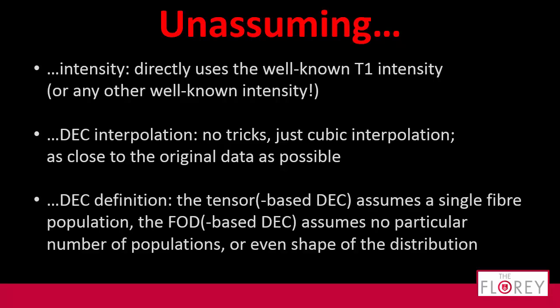And my DEC definition was also quite simple, even though it used a more advanced FOD. It made less assumptions, because the tensor assumes a single population. The FOD assumes nothing at all.